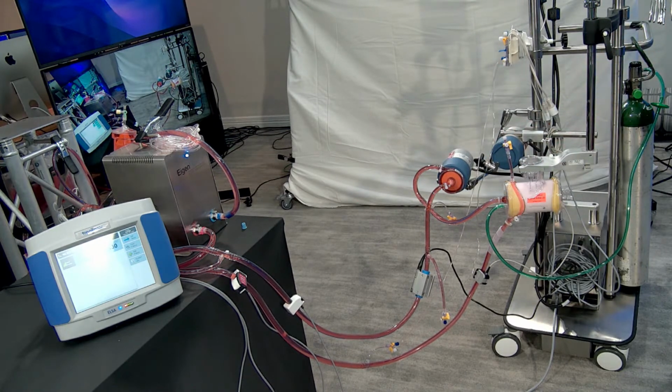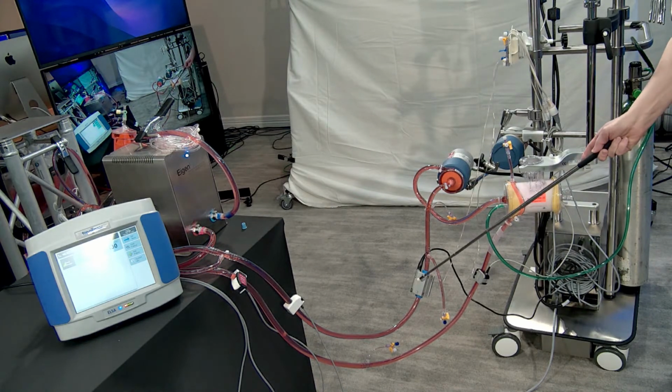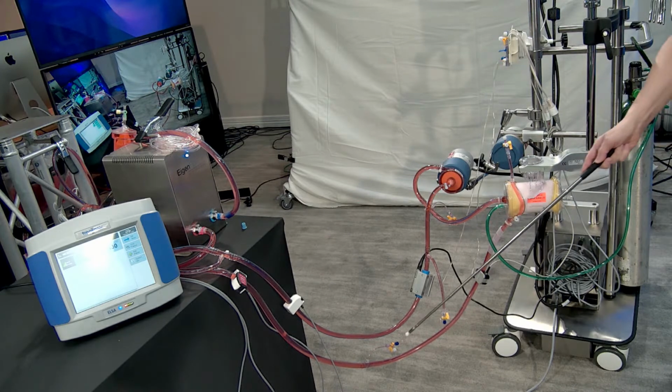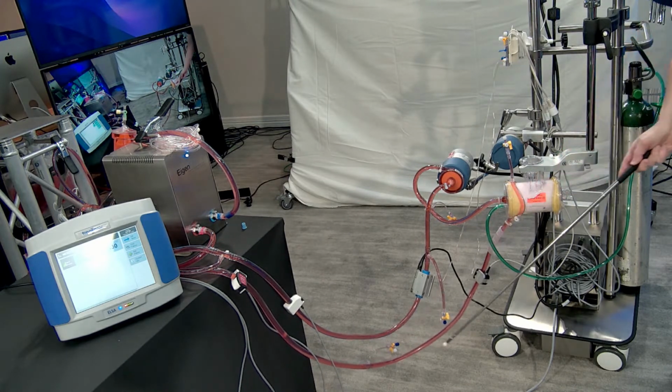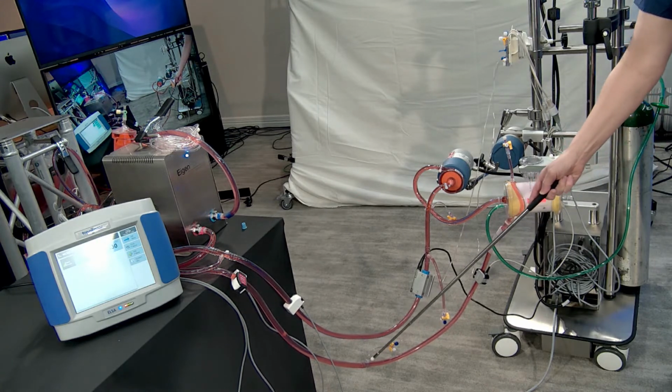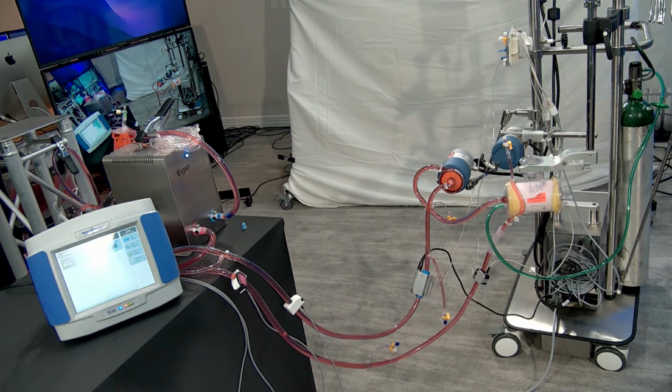Very good. Could you show the bubble detector? On our venous side over here, we have an inline bubble detector. We've also got some pressure monitoring lines, our pre-pump and our post-oxygenator. We have those available for our scenarios so that we're able to show you changes in pressures. So now that you've done the circuit, let's go over all of the different screens.